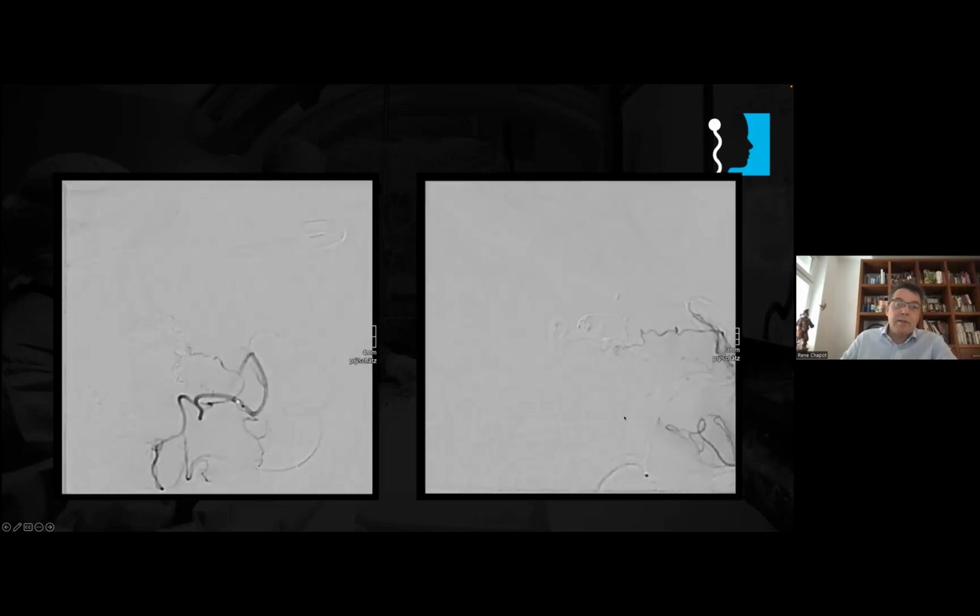But we continue embolization with embolization of the second vein, which is this one. And at the point where the embolic agent goes back to the main vein, then we do the plug. Here is a plug of NBCA. And because of the plug of NBCA, it's possible to force, to continue to inject back in the AVM through both microcatheters. So we continue here.